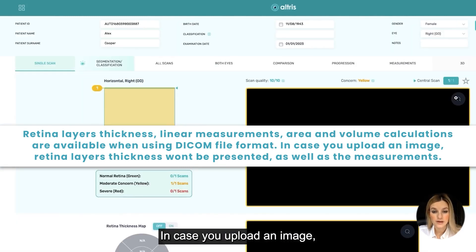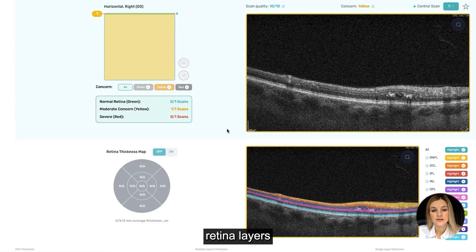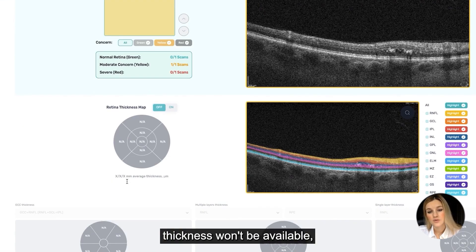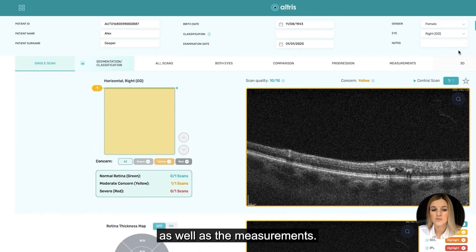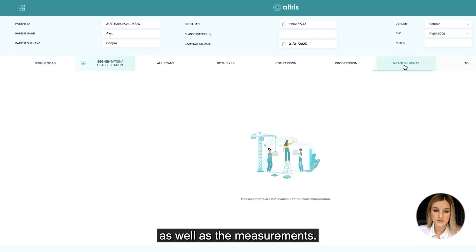In case you upload an image, retinal layers thickness won't be available, as well as the measurements.